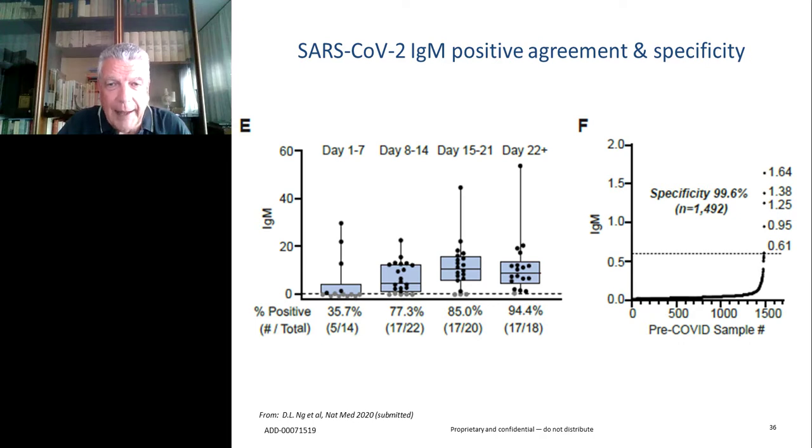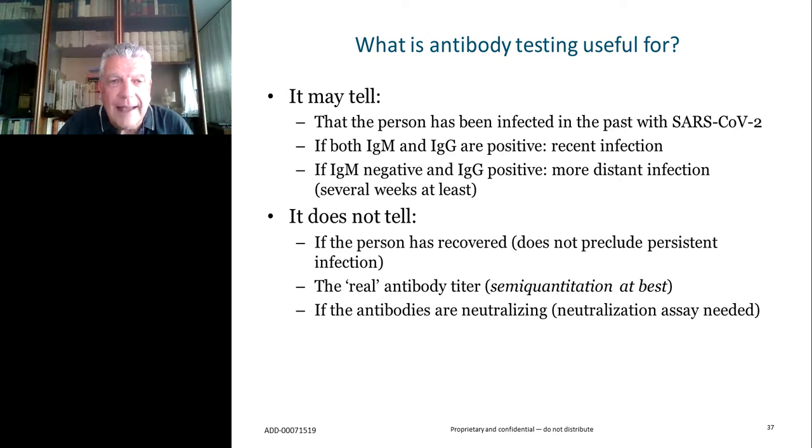But here again, we do have some data to show that the prototype assay from Abbott for IgM to SARS-CoV-2 that was used in this paper did show a very good specificity as well, I would say at the same level as the IgG assay we have seen before. And again, you see a good distribution and very few samples around the threshold. So this is promising, in the sense of what we have seen before, that is combining testing separately for IgG and IgM. Then, if you wish, what is antibody testing useful for in general?